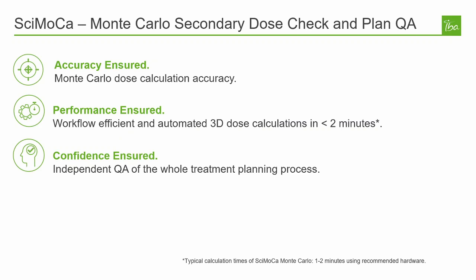So to summarize, the high-quality Monte Carlo implementation of SciMoCa and machine-specific beam models offer a very high specificity and sensitivity for your QA process. SciMoCa is deployed on a service-oriented architecture with a streamlined web-based interface that fits seamlessly in your clinical workflow. The software features a powerful and comprehensive set of analysis and reporting tools that run in an automated fashion with minimal user interaction. And there's no proprietary hardware required, so you can install SciMoCa on your existing hardware infrastructure.